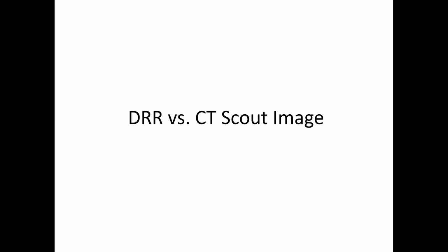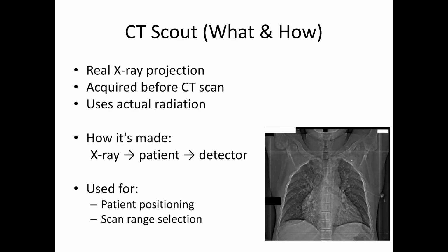Hey everyone! In this video, I'll compare a CT scout image and a digitally reconstructed radiograph or DRR. Both are two-dimensional projection images and can look similar at first glance. However, they are created in very different ways, used for different clinical purposes, and have different geometric properties. Let's dive in.